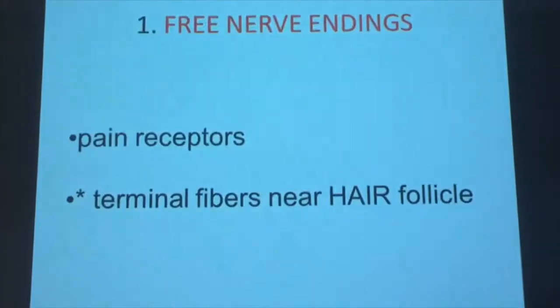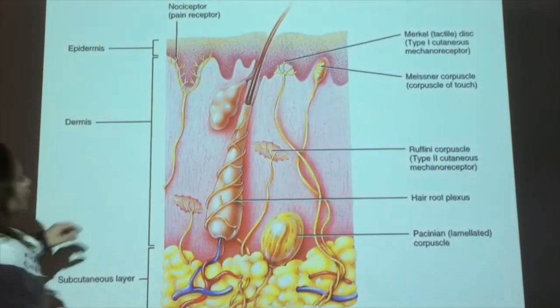Go to the left. Again, go back to where the skin was. That's it.